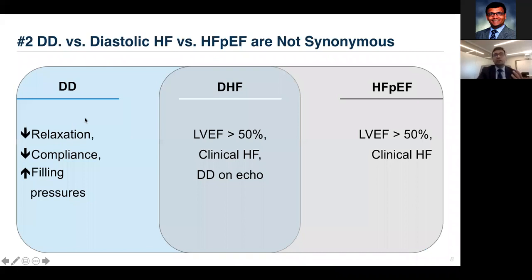Diastolic dysfunction means that there is a milieu of an abnormal relaxation accompanied with other features that suggest that there is increased stiffening of the ventricle or altered relaxation forces in the ventricle. But the left atrial pressure may not be elevated. Filling pressures may not be higher at rest, and exercise or exertion may be needed for creating the features that are associated with elevated filling pressures.